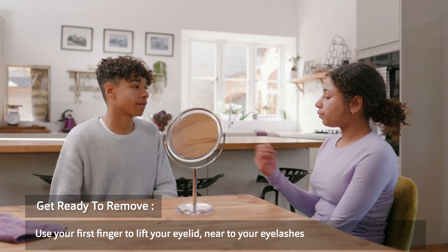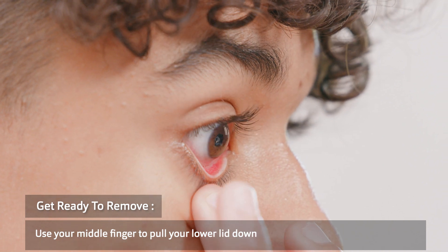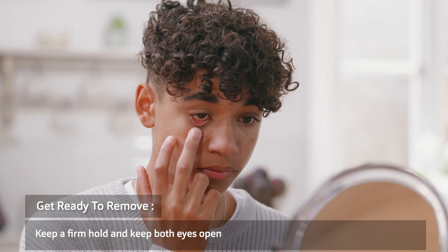Using your first finger on the opposite hand, lift your eyelid, holding at the line of your eyelashes. Using your middle finger of your free hand, pull your bottom eyelid down. Keep a firm hold and keep both eyes open.